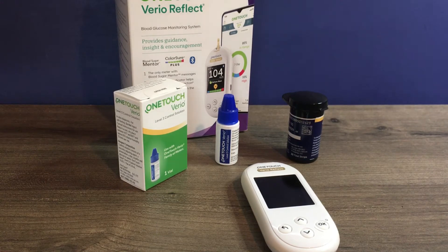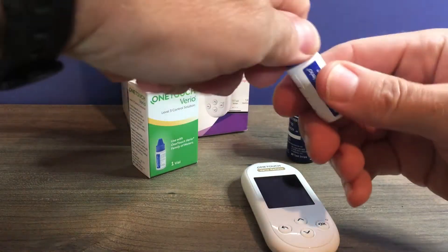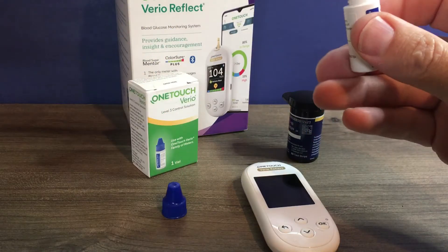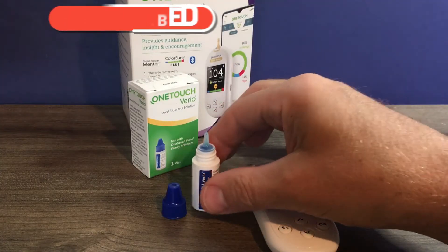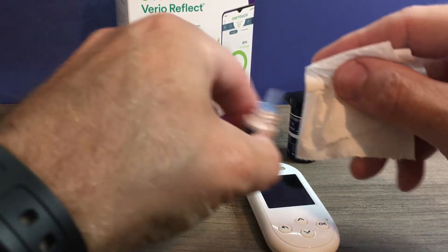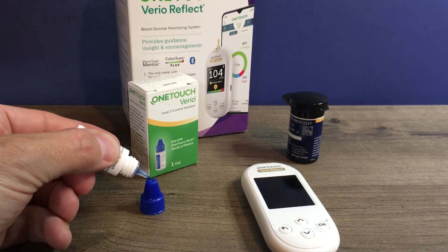Let's perform a Control Solution test with the Vario Reflect Meter using the Level 3 Control Solution. You want to gently shake the vial, then discard the first drop into a clean tissue. Then wipe the top of the container as well as the tip with a clean, damp cloth. Then you can apply a drop of the Control Solution to the top of the container.